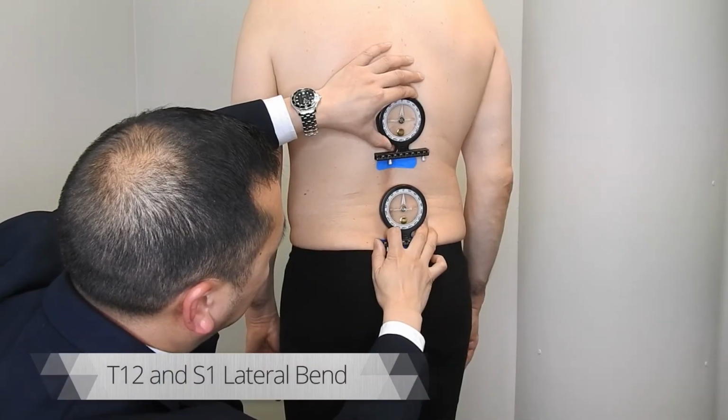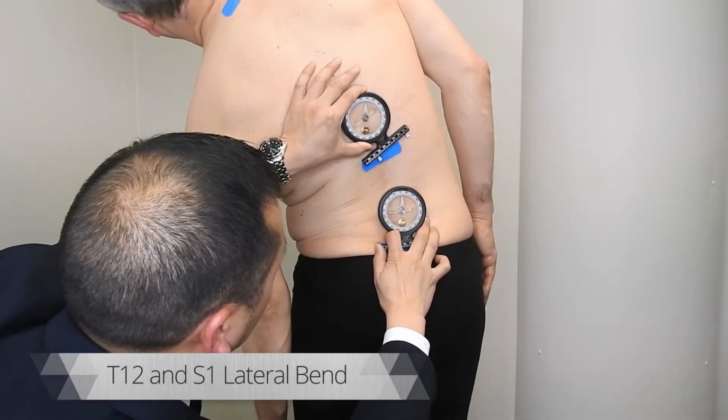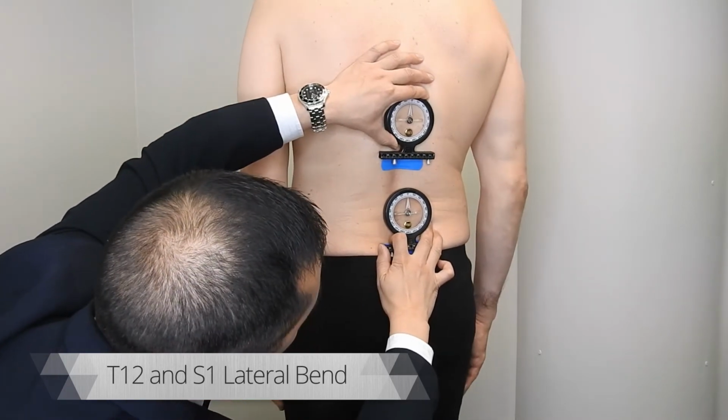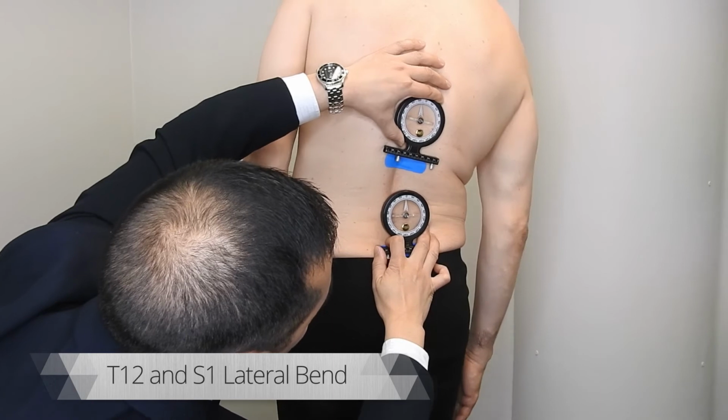Lumbar spine, lateral bend. The inclinometers are at horizontal 0. Subtract S1 from T12 to obtain the lateral bend.